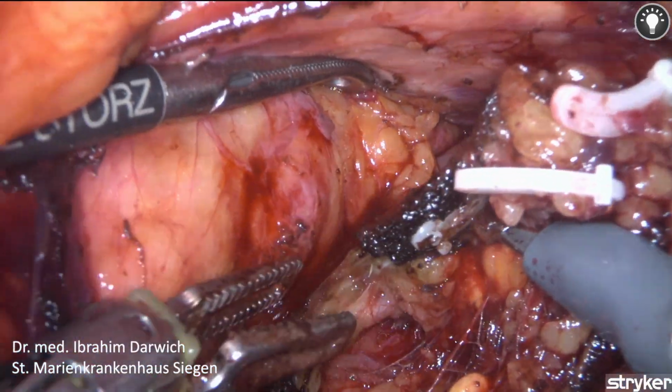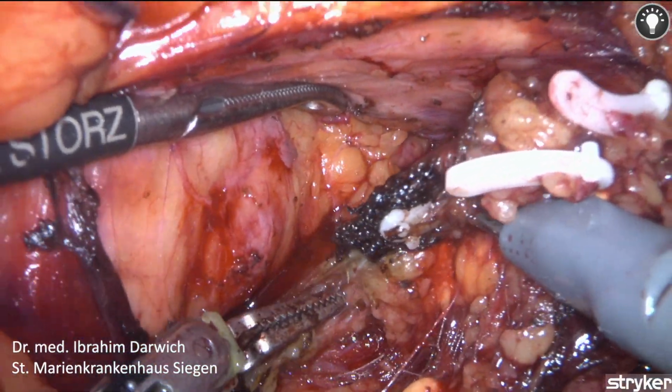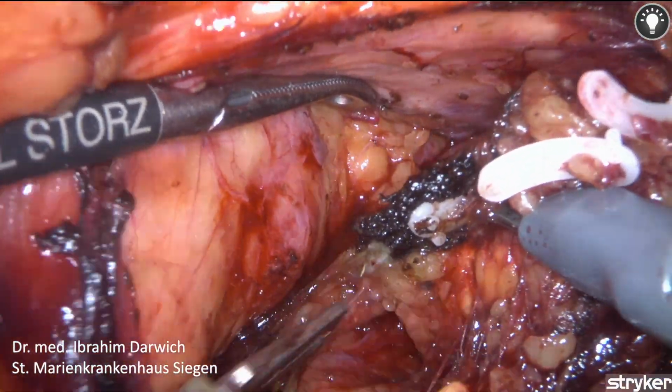Further suprarenal arteries are encountered, clipped, and divided on the medial and cranial aspect of the adrenal gland.